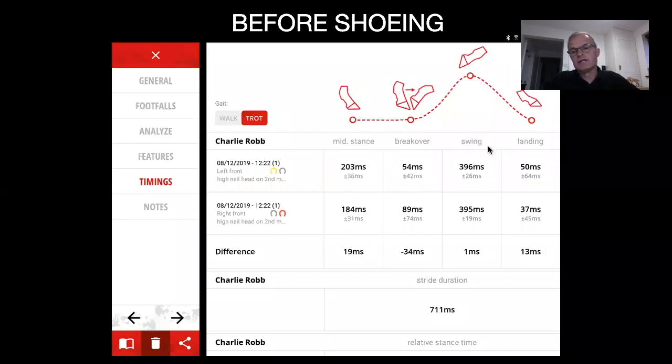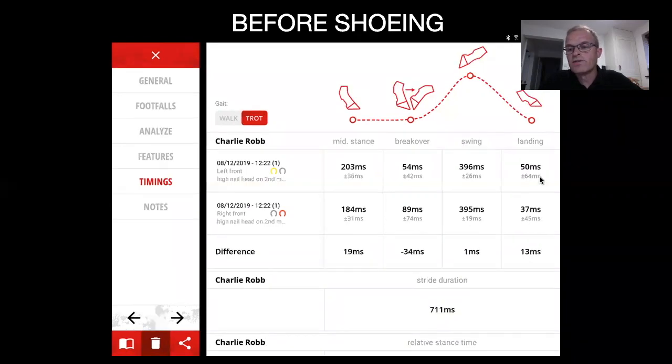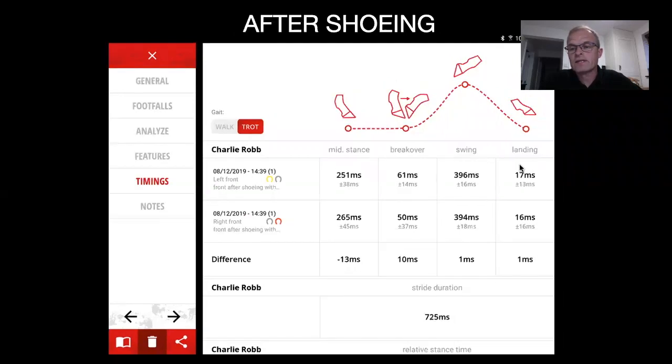So again, the timings table is really important, and that's not always the first thing when you first start using Werkman Black. It's not always the first thing that we look at. After shoeing, when we get these numbers more in line, so you think back, 50 milliseconds, a 13 millisecond difference. Landings come down 17 to 16 and a 1 millisecond difference between left and right. So again, that's a good result for us.